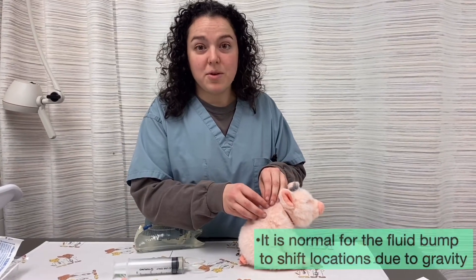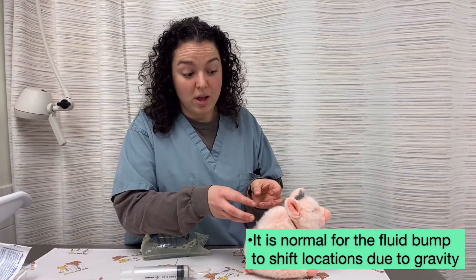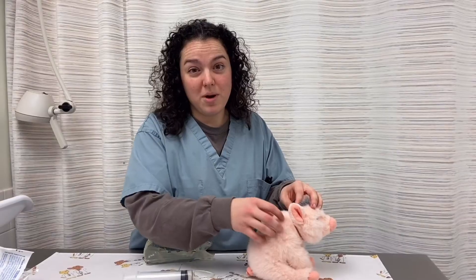You should see a large lump where the fluids were given. That's perfectly normal, and the body will absorb it within 24 hours or less. Sometimes the lump will shift around the body due to gravity, and that is totally normal as well.